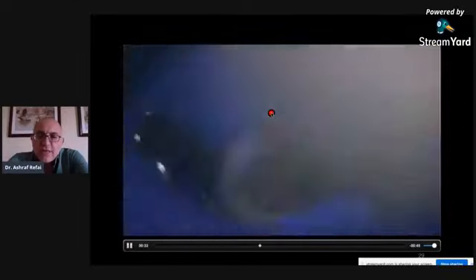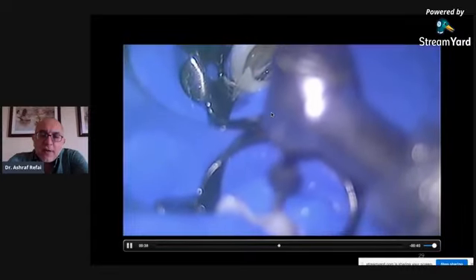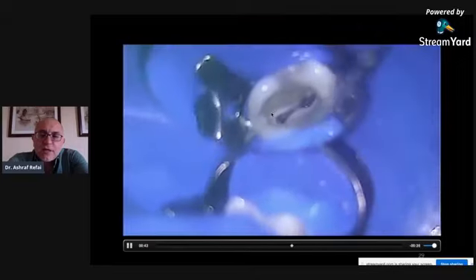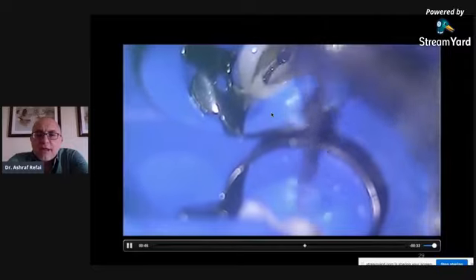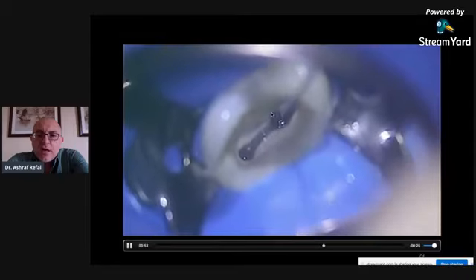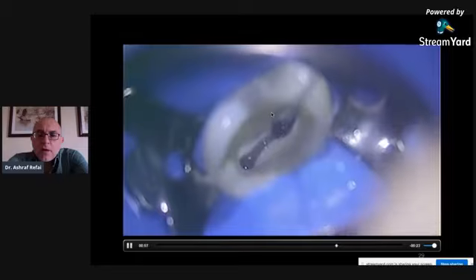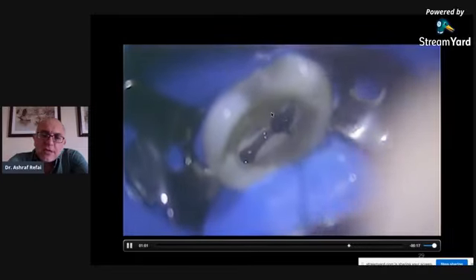Usually if this happens, as a dentist, you should do one thing and one thing only, and that's obturate. But I was still a little irritated that there was an instrument inside the canal, so I used my rotary file in an anti-clockwise motion. This anti-clockwise motion resulted in me loosening that instrument, and I managed to get that instrument out.